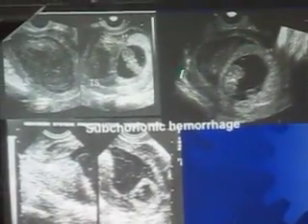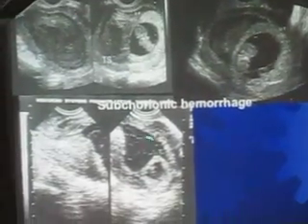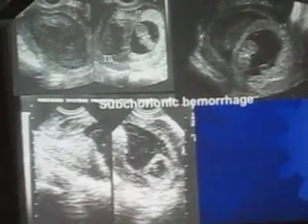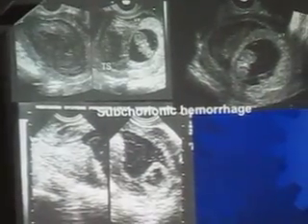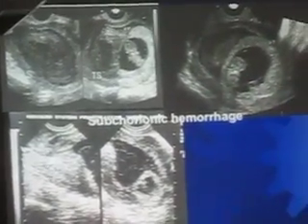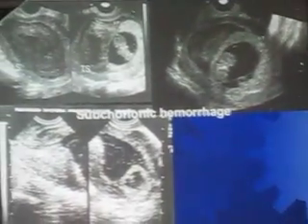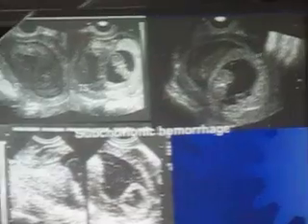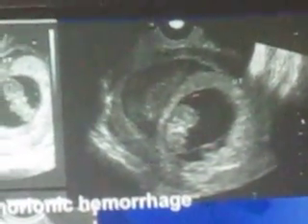But when the subchorionic bleed becomes very large, as you see here, but still the fetus is viable here, or I can see extremely large subchorionic hemorrhage, there is a high chance that the baby may not make it. But even then, as long as the pregnancy is viable, we just wait and watch. We will take preemptive steps. Some of them with a large subchorionic hemorrhage who have gone to the second and third trimesters may end up in an intrauterine growth restriction, which we have seen.